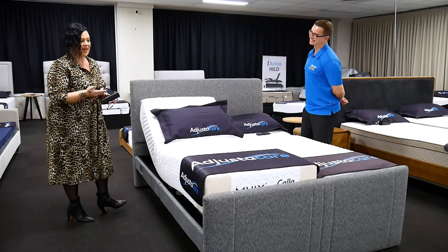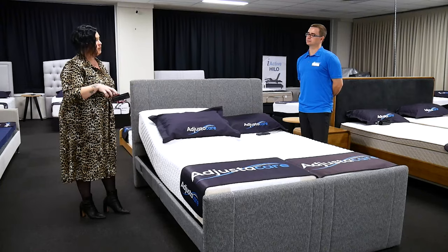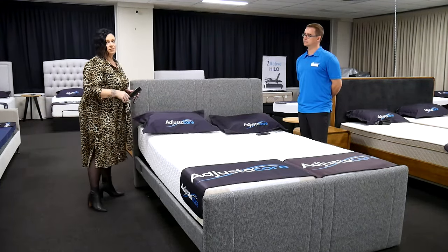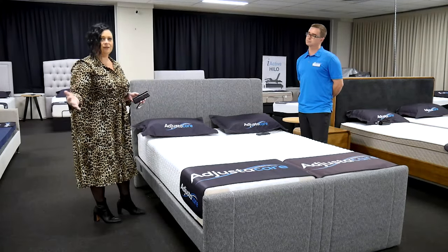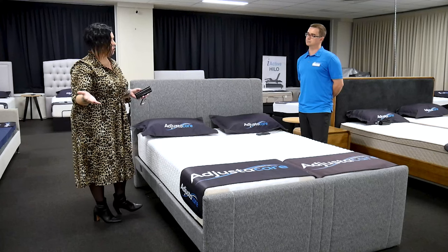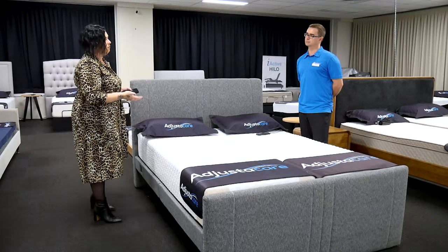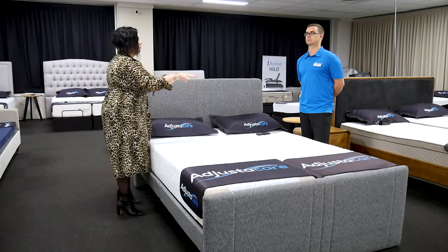It's available in split-queen and split-king options. A lot of other retailers don't have the split-queen option, so that's quite unique. Bed linen can be accommodated to fit it as well — it includes two fitted base sheets and then a queen flat sheet over the top with two pillowcases. So for clients transitioning from a standard queen bed, all they need to replace in their linen sets is the fitted sheet.